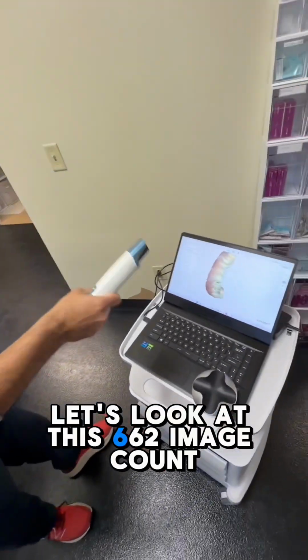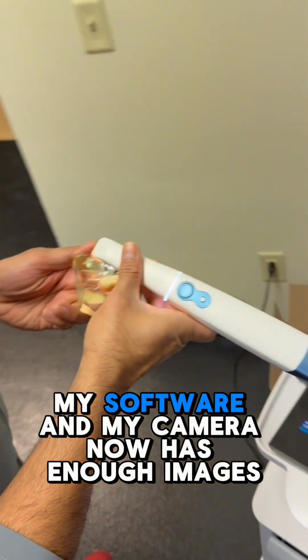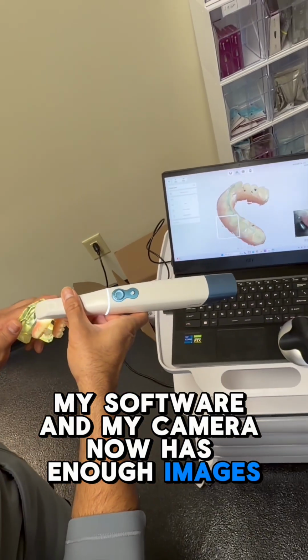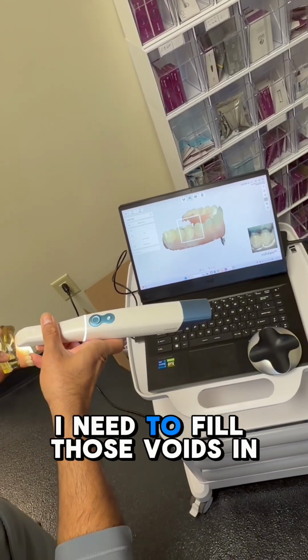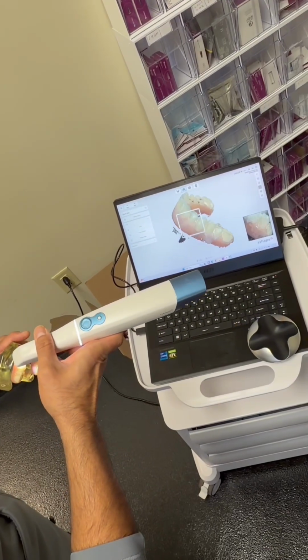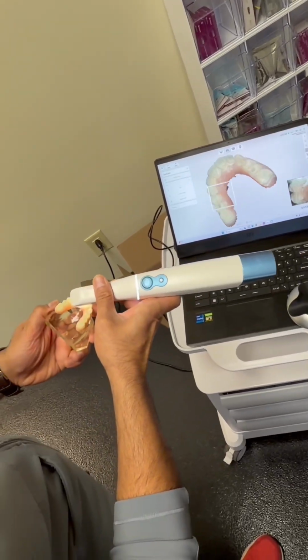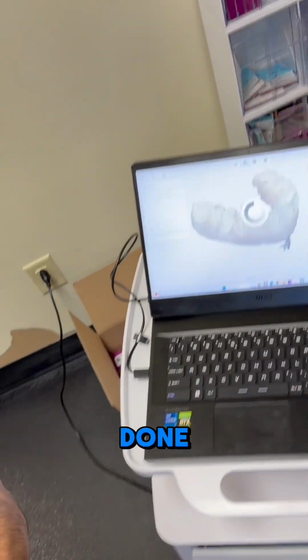So again, let's look at the 662 image count. I have a few areas of voids, but my software and my camera now have enough images that I can start wherever and just add images wherever I need to fill those voids in. It will move in much faster. Done.